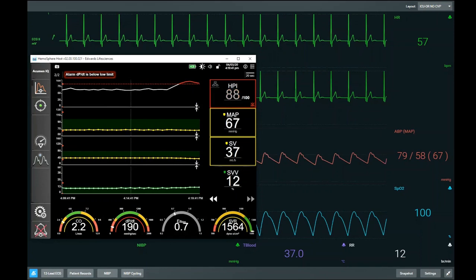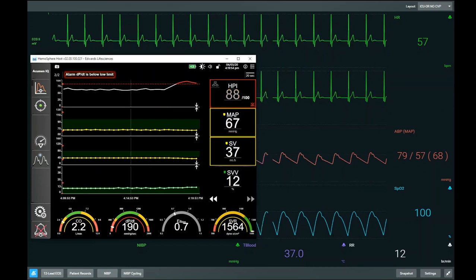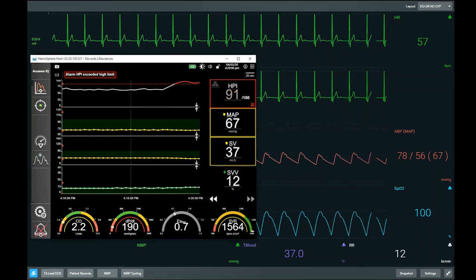So what is DPDT? It is change in pressure over change in time. It's a measure of the systolic slope from a peripheral arterial waveform. And actually, more accurately, it's the maximum pressure change divided by time from that peripheral arterial waveform. And what we use it for is as a surrogate for left ventricular contractility.